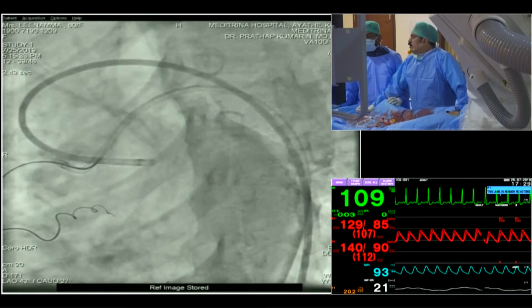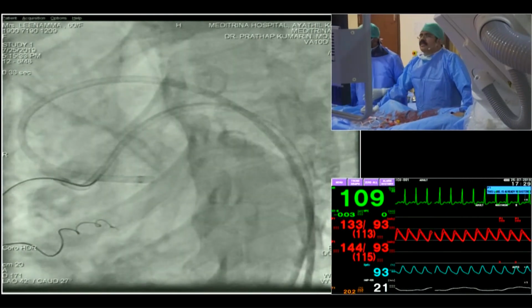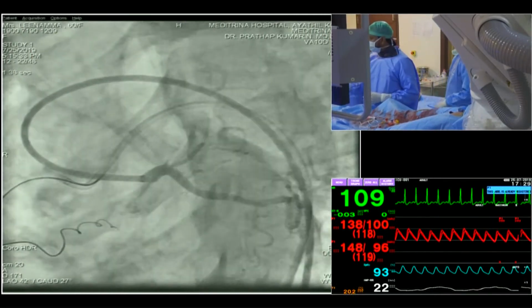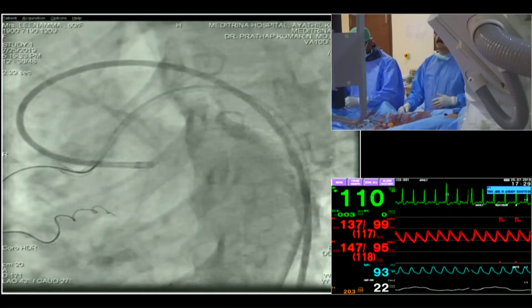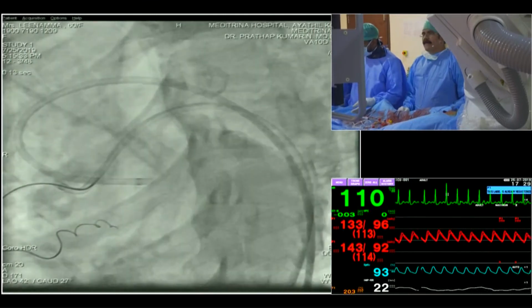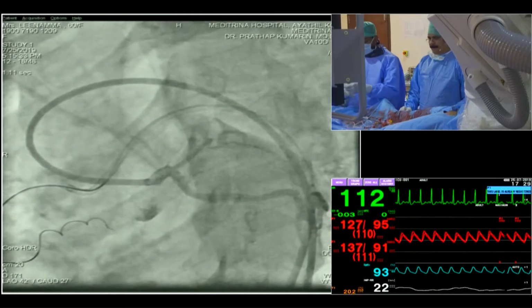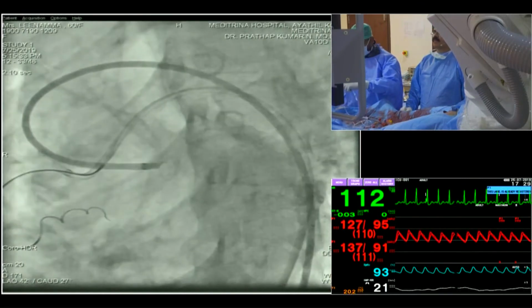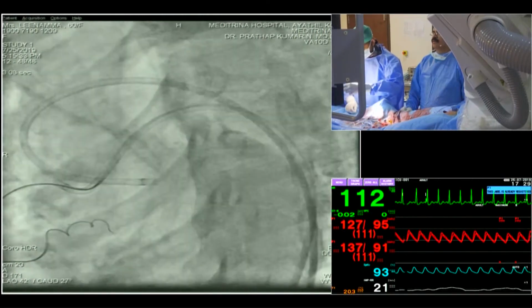Can you first just give me an attempt antegrade? I'll try it. May I try an XTR? In the same situation, yes. But of course, there's a problem. But I have to say that at least the first half centimeter is in the true lumen. So at least you got an indication where you have to push, because it seems like it's relatively straight, although it's calcified, maybe dissected and whatever. But looking at the retrograde possibilities, I have to say that all these tortuosities are just a nightmare. So, I will try anyway.